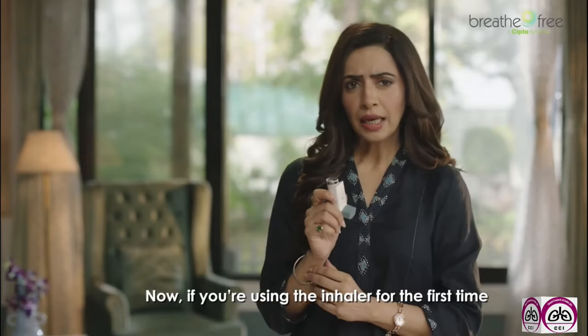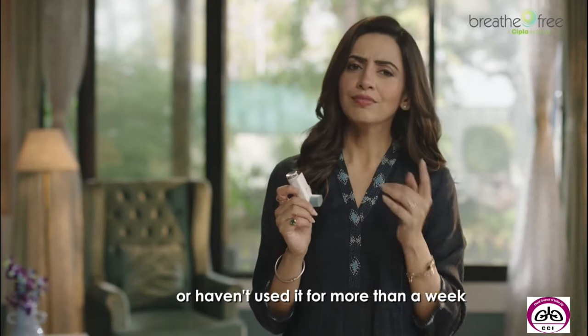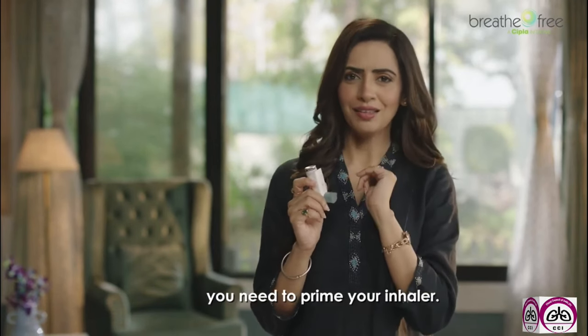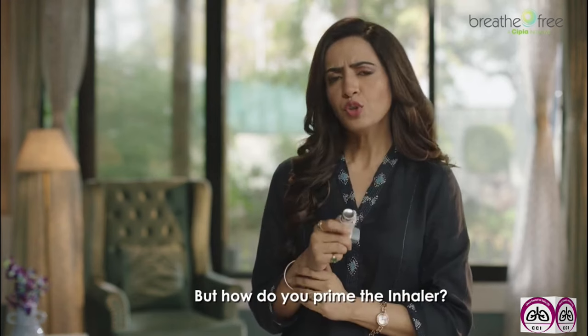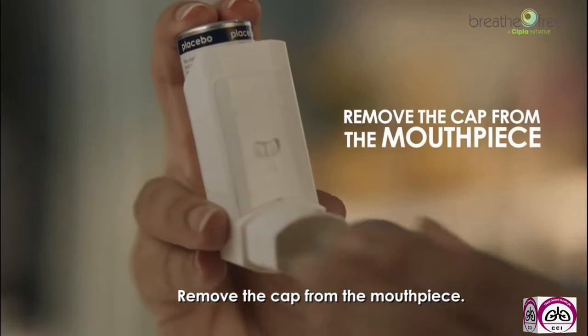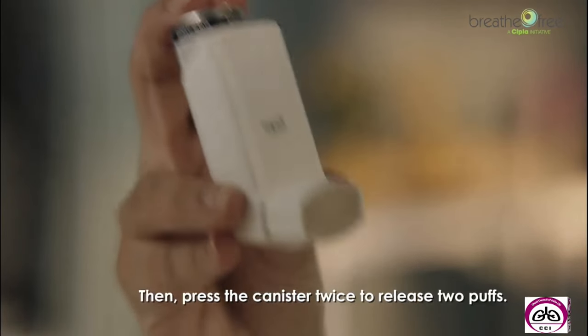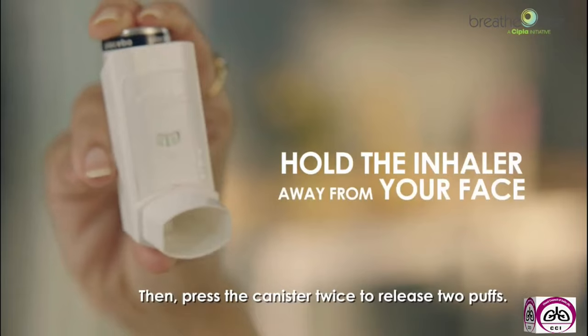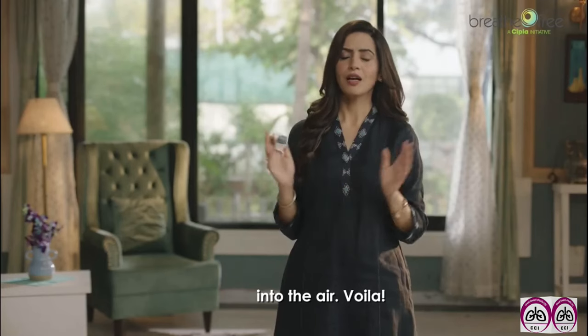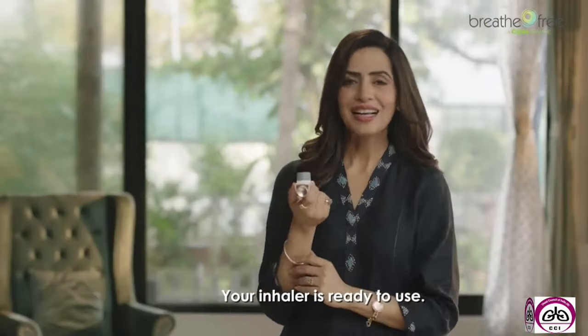Now, if you're using the inhaler for the first time or haven't used it for more than a week, you need to prime your inhaler. But how do you prime the inhaler? Remove the cap from the mouthpiece, give the inhaler a good shake, then press the canister twice to release two puffs into the air. Voila! Your inhaler is ready to use.